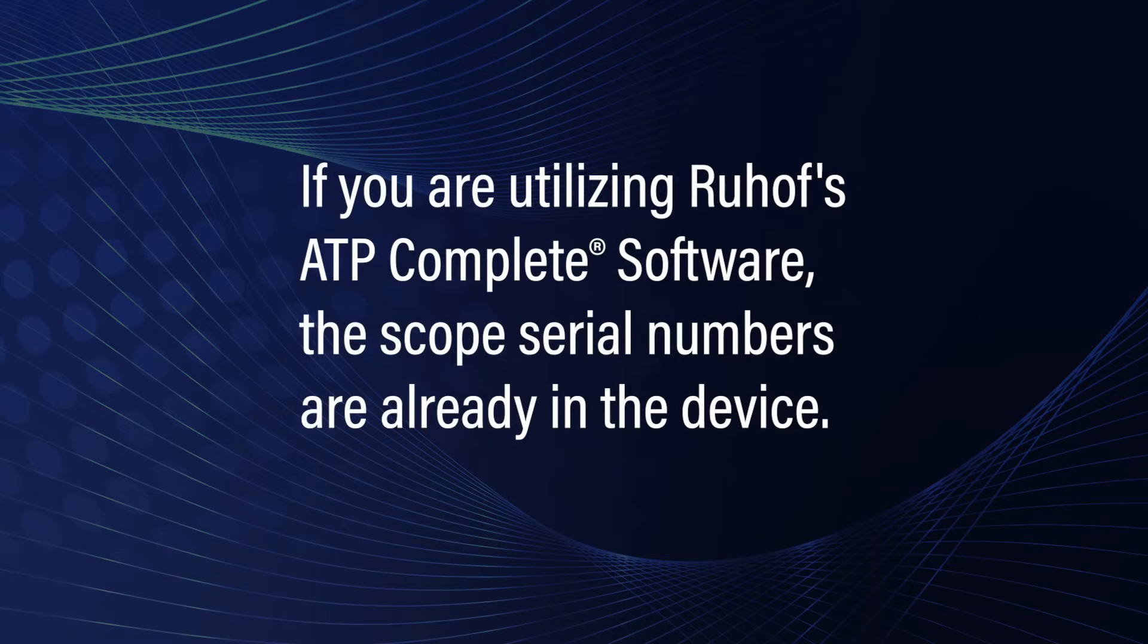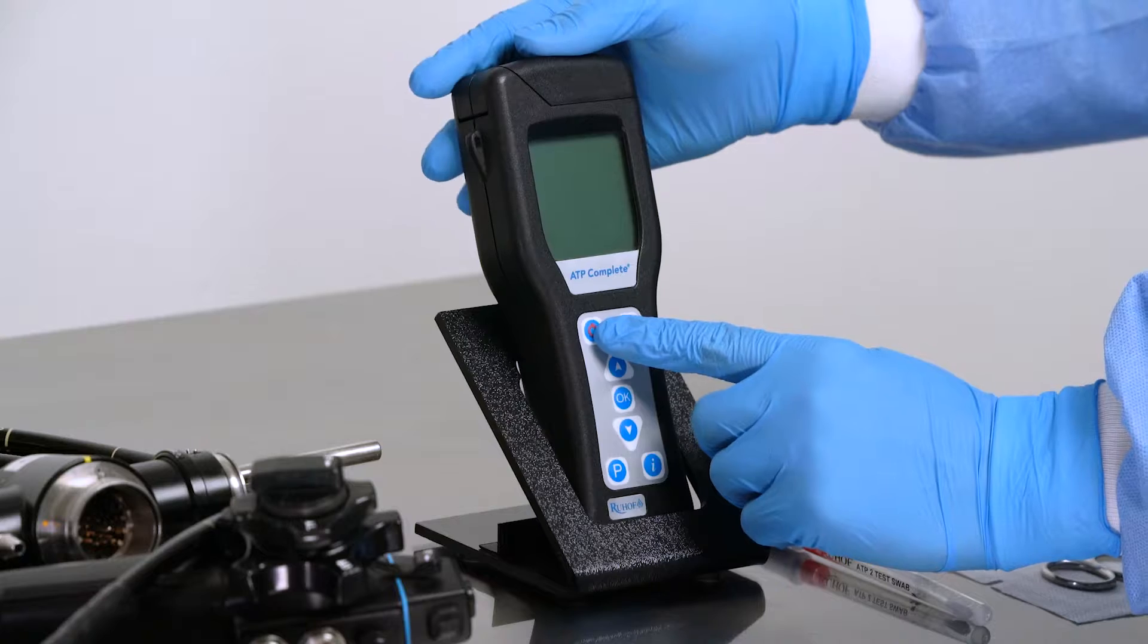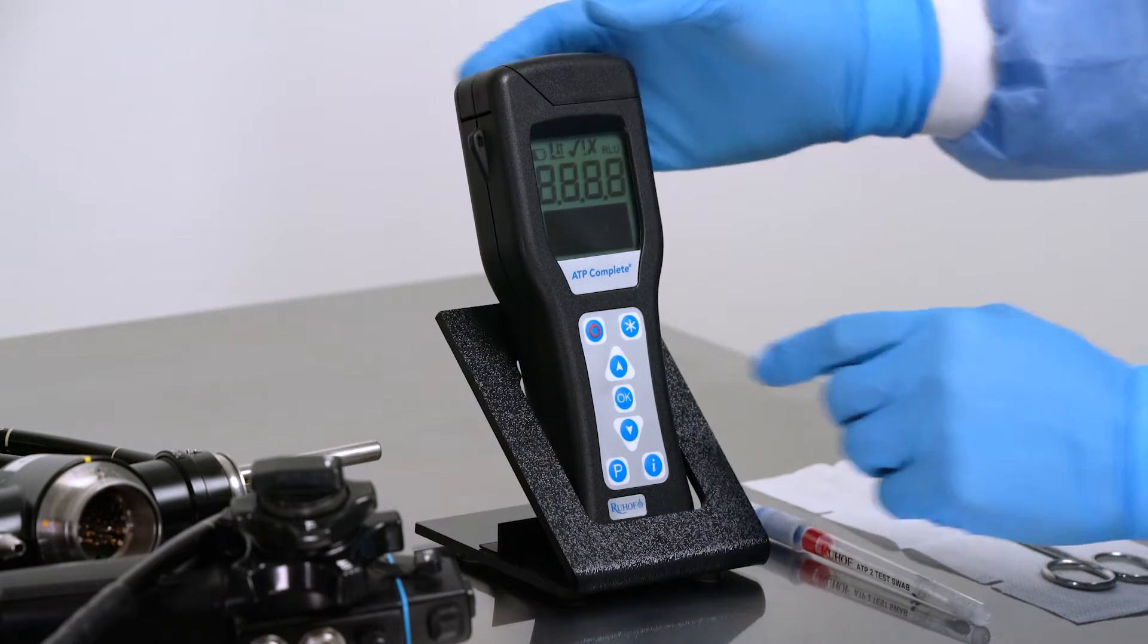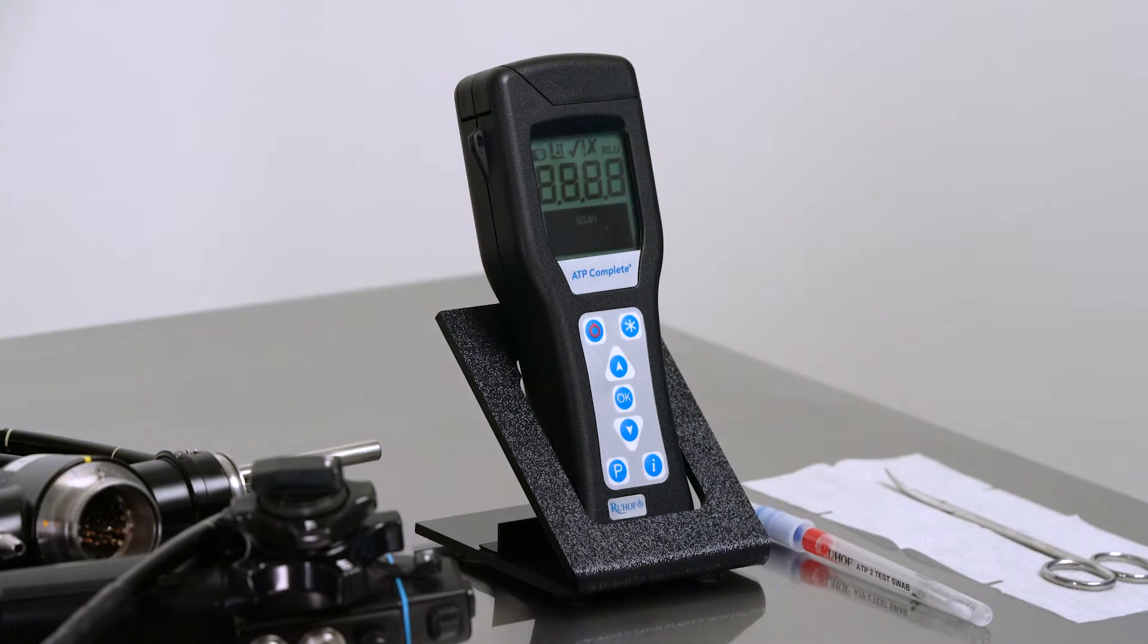If you are utilizing Ruhoff's ATP Complete software, the scope serial numbers are already in the device. When the device is turned on, it will conduct a 15-second self-calibration sequence to ensure it is functioning properly.